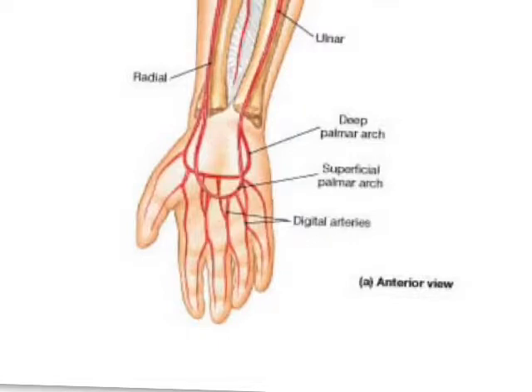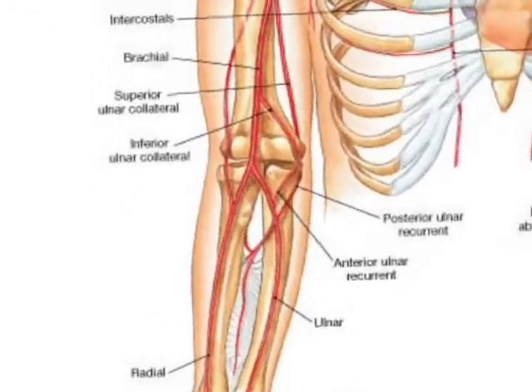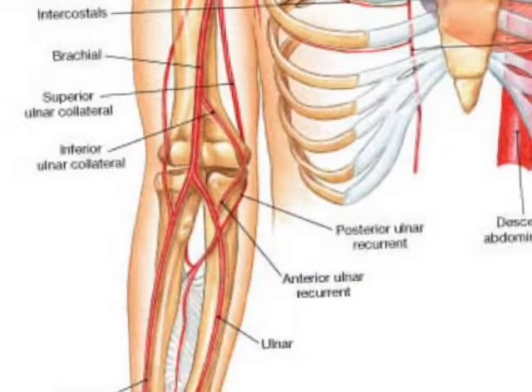We don't really like this area, though. What we like are these brachial arteries, and we sometimes talk about them as antecubital access points, areas in front of the elbow. That's all antecubital means. It means in front of the elbow. So the brachial artery is our artery of choice, and it has these different little branches right here. So we need to be aware that just below the elbow it has a fork to it and the blood is flowing in this direction. So as we're palpating around on the patient, we're going to be looking, okay, where is the fork? Okay, I want to go somewhere probably north of that, right?